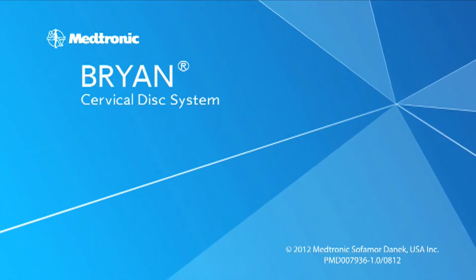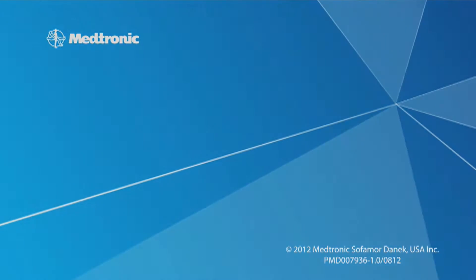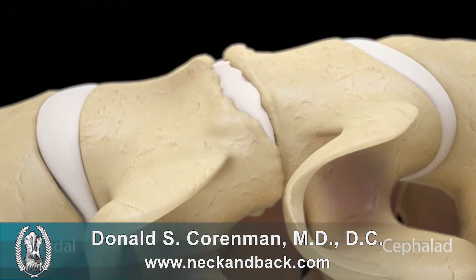Hello, this is Dr. Kornman. We're going to talk about the Bryan Cervical Disc System. This is an animation of the insertion technique.